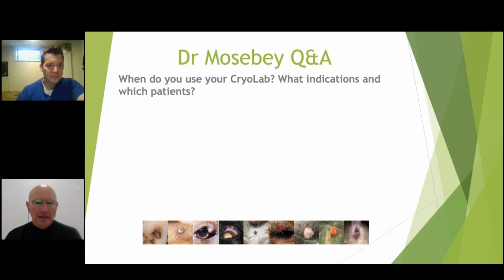Mm-hmm. And so last question associated with this is, are there any limitations in terms of age or your preference in terms of age of patient when you use cryosurgery? No, I really say age has nothing to do with it. It's more comorbidities, and that's why sometimes we go towards this. You have valve disease, you have bad kidney disease, and we just don't want to go through anesthesia with any extra risks, or the owner just doesn't want to. So we end up doing it more frequently, I think, on older patients.